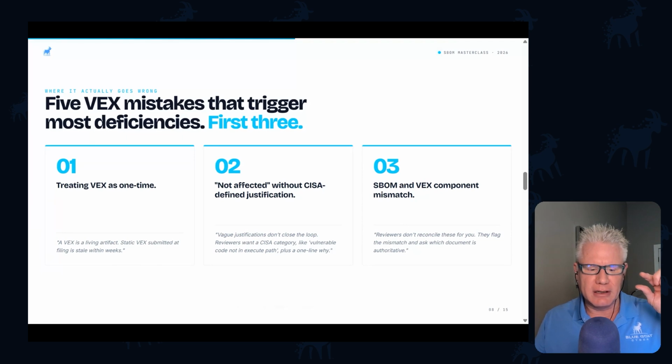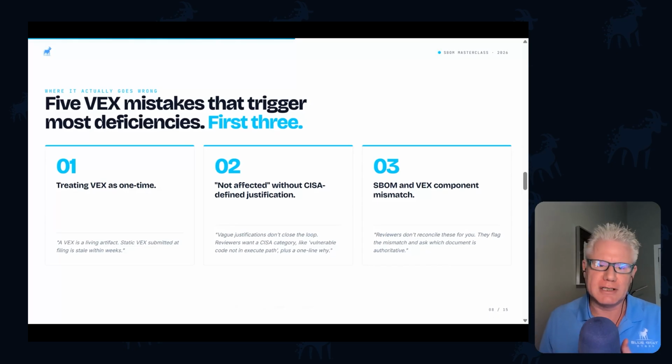So I have a software component. I do my vulnerability analysis against that specific software component. That has to match. It's a 1-to-1. And if there's a mismatch, the FDA is going to kick back your submission as a deficiency. They're not going to do the work for you and fix it. They're just going to say this is inaccurate and incomplete, and you have to fix it.